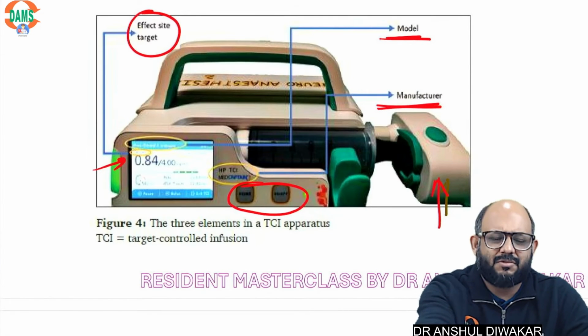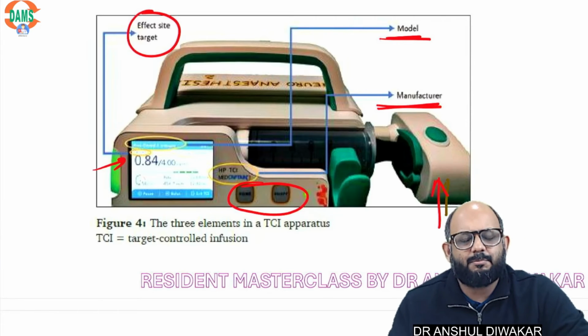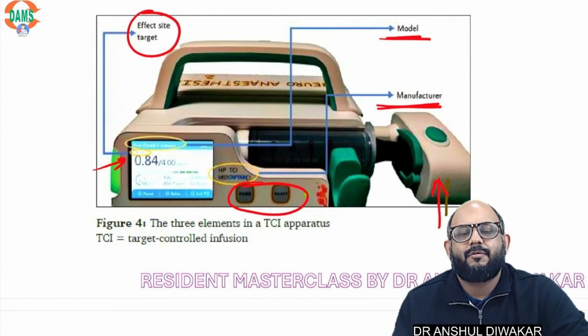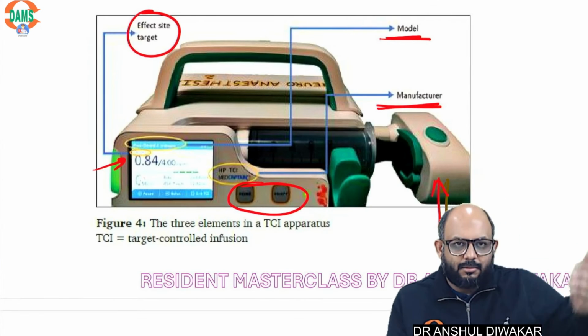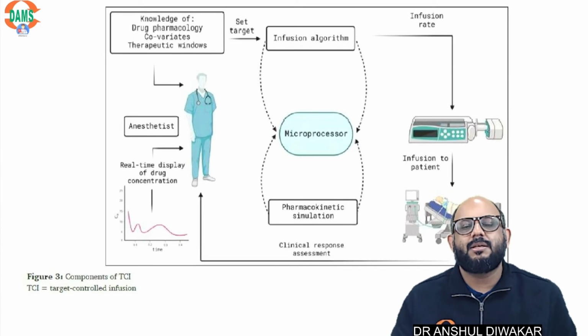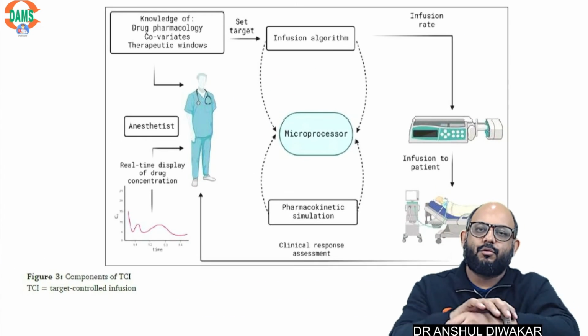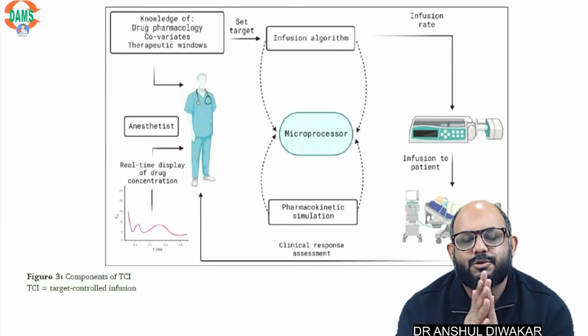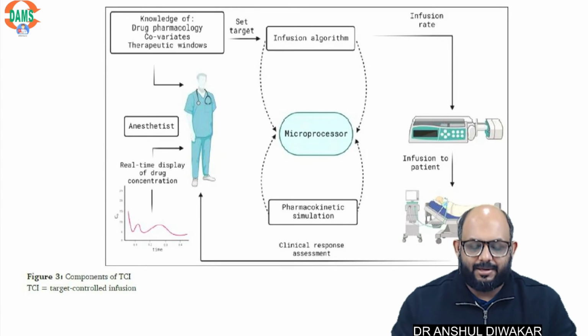And this is something which is very common. In fact, these are the same pumps which are there in your cardiac ICUs, just we don't use the TCI part of it. When you have a cardiac case and you see so many pumps, you don't really see, but they all have a TCI mode. So if you start playing with it, you will often find a TCI mode. Now this is just to try and make you understand about the TCI.